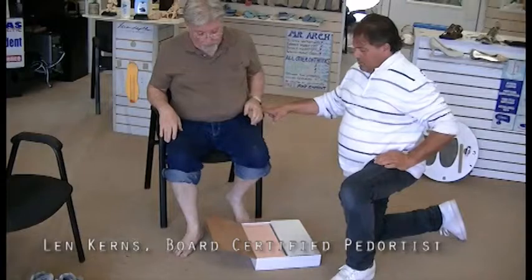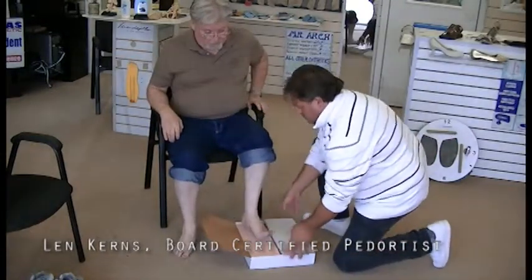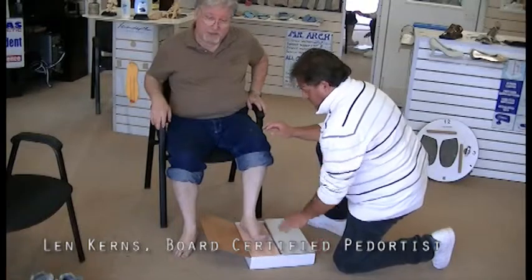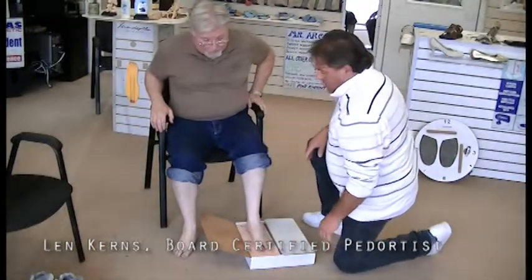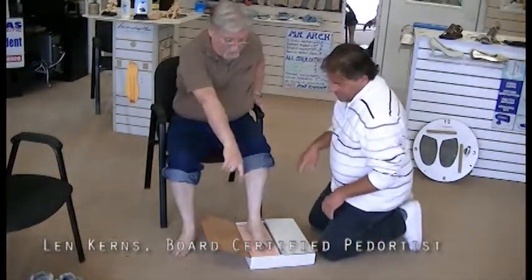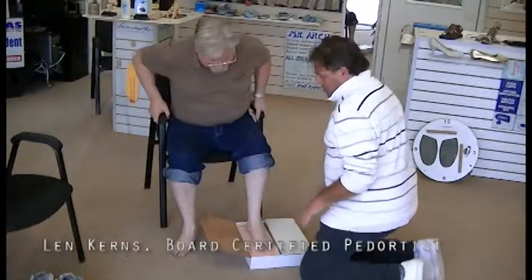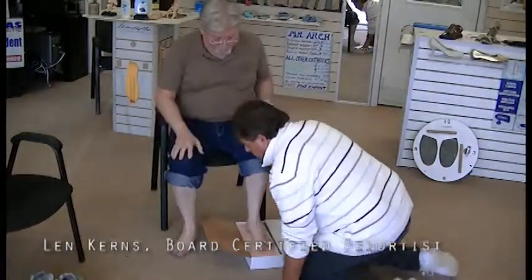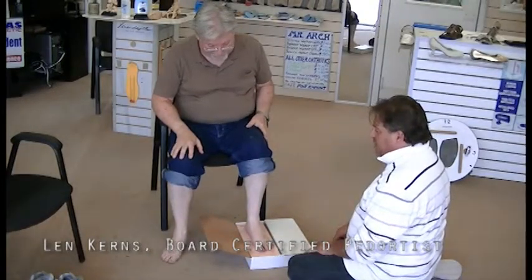Now Mark's going to show you how to cast my left foot. Now bear with us because he's going to try to stay to the side, which is awkward, but we're planting my foot in the middle, and I'm just relaxing it. Mark, you can get more in the front so you can turn the box. Okay, so in this position, the patient's foot is just gently resting on the foam. He's not putting any pressure down.